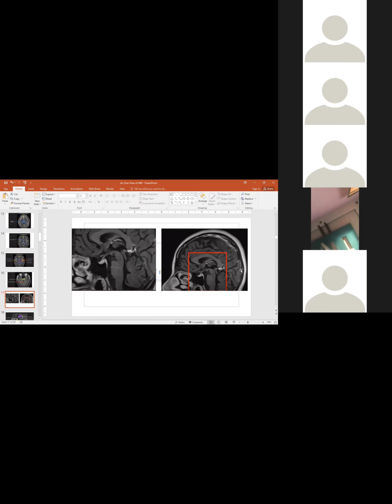So this is the sagittal section of the brain, showing you the midline sagittal section, and this structure is known as corpus callosum, as I have already told you that it integrates the right and left hemispheres. It has some parts, the genu and splenium of the corpus callosum. This is the brain stem, and behind the brain stem is the cerebellum. And there are a few structures which are anterior to the brain stem. They are very important to see, to visualize and to report.